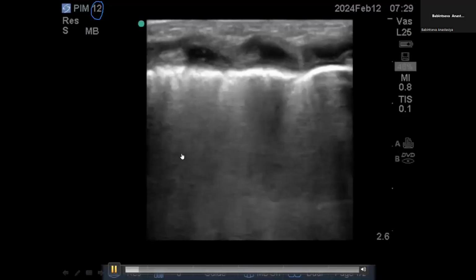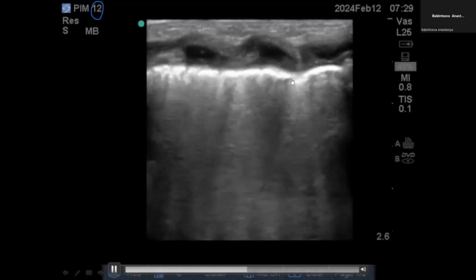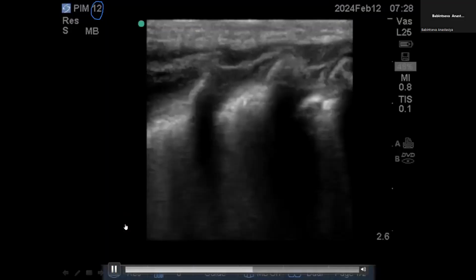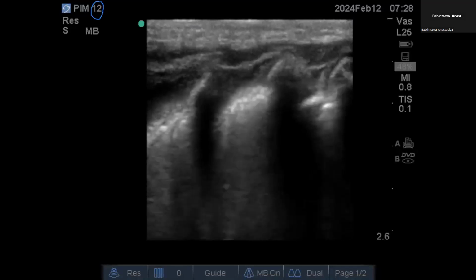Okay, and here, can we say it is a whiteout lung? Yes, and there are a few subpleural consolidations with the whiteout lung. So yes, I'll score it as 3 if we start scoring for RDS. That's correct. And this, Dr. Alok, in this first picture, we'll score it as 2 because it is not a whiteout lung. My gut feeling is 2.